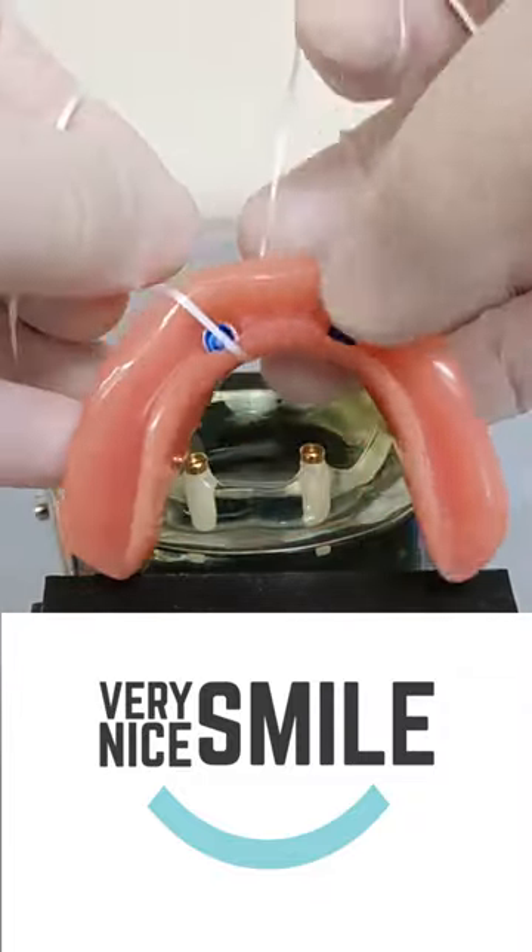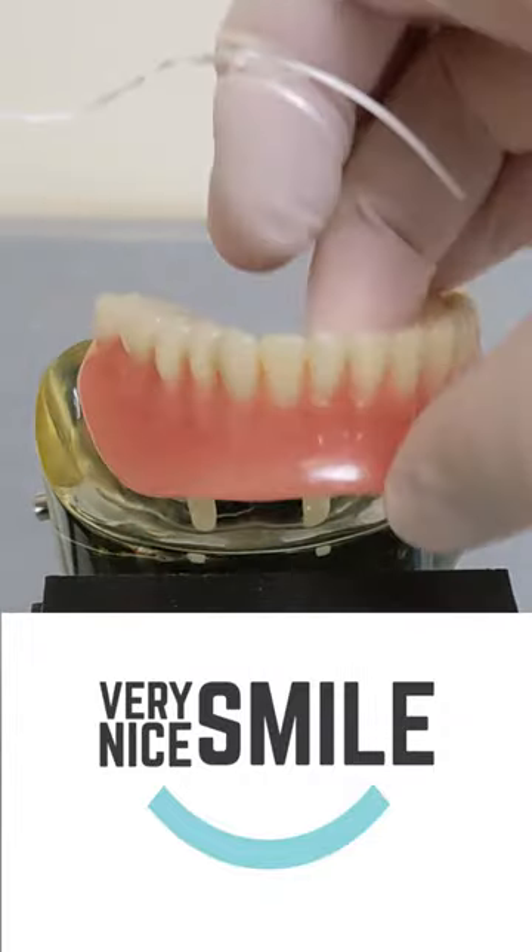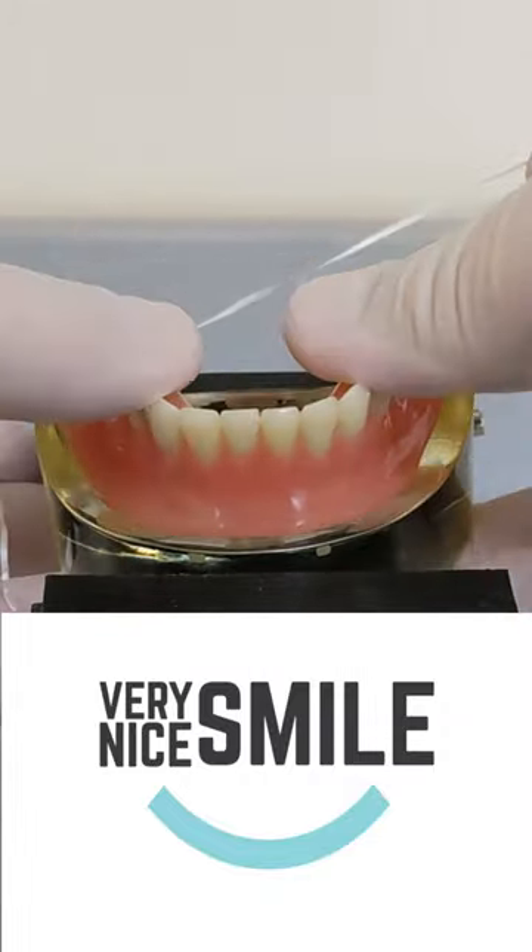Slide the floss forward until it's up against the snap, then gently pull up and the denture should pop right out.